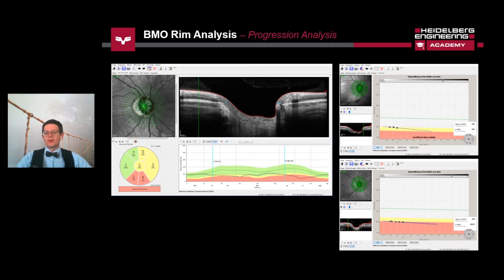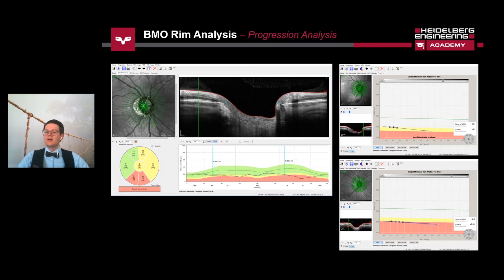Glaucoma is a progressive disease. Therefore, identifying change over time is an important step in confirming a diagnosis and monitoring treatment efficiency. Establishing if there is any progressive loss of tissue over time is useful supporting evidence. Interrogating the progression in the temporal superior and temporal inferior sectors may reveal a rate of change that is significantly greater than the global average rate of loss.